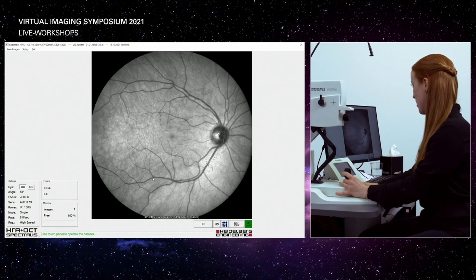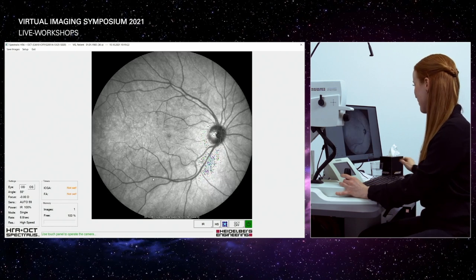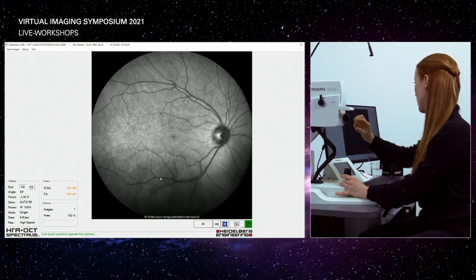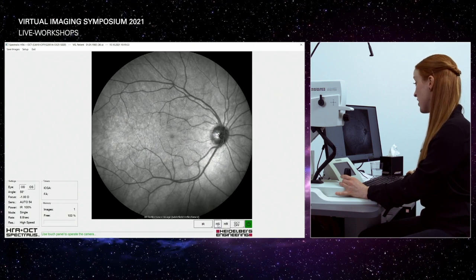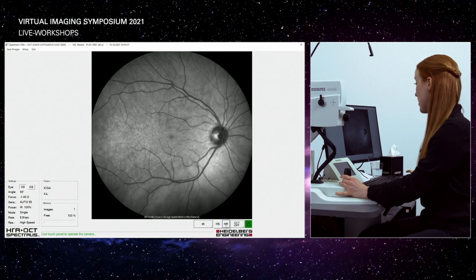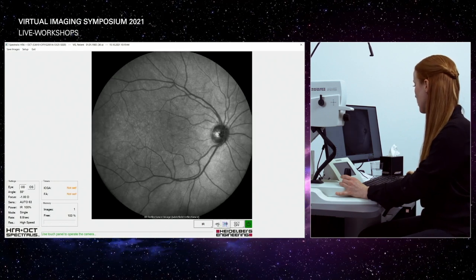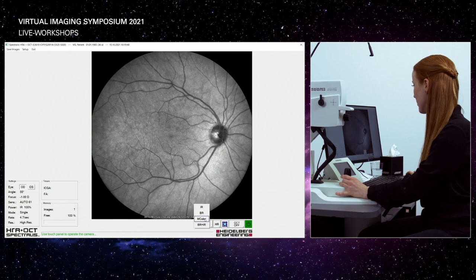But now we want to have some multicolor imaging, and you remember, we can change our focus a little bit in direction minus 1, and then maybe activate the HR for the high resolution mode to have more points of measurement in our wider field of view. And then we will activate our multicolor imaging. So it's going to be bright again.